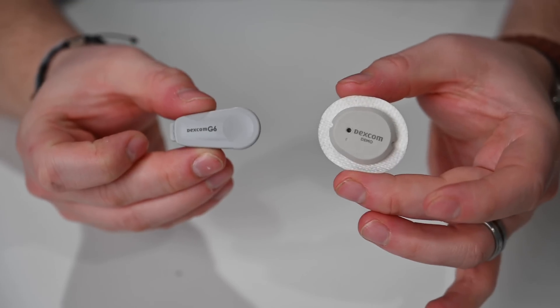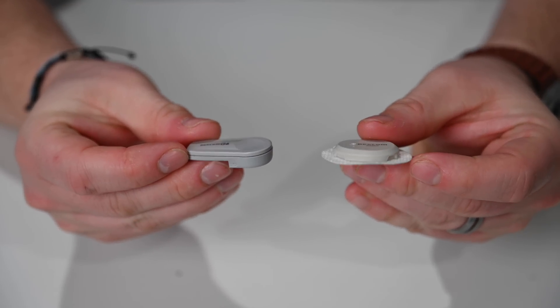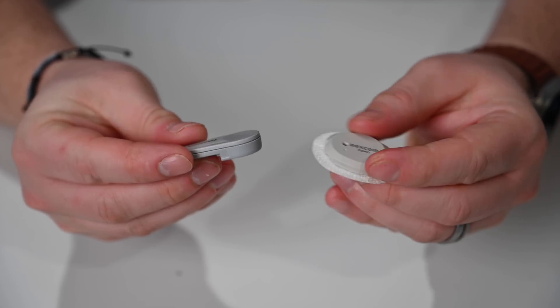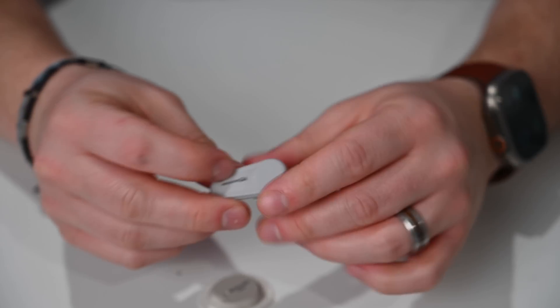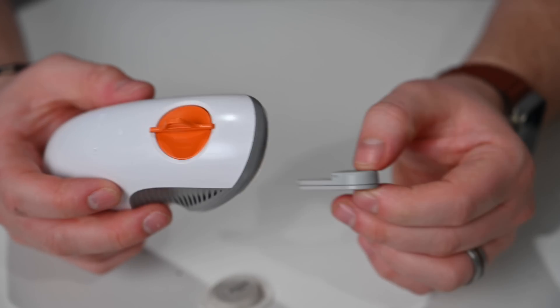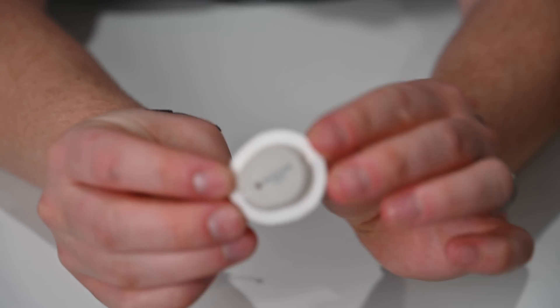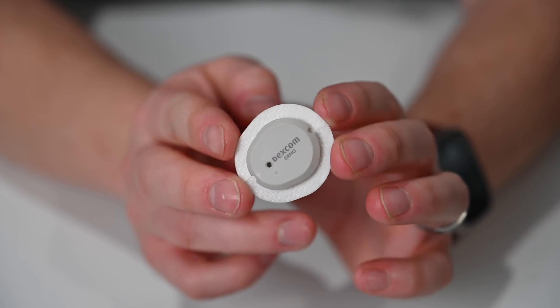Let's take a look at the G7 alongside the G6. Dexcom says the G7 is 60% smaller than the G6. Looking at the pieces side by side, it's a little misleading because the G6 doesn't look much different in terms of overall volume — but that's because the G7 is an all-in-one piece. This is everything you need: the adhesive, the transmitter, the sensor — all in one little piece that gets disposed of after your 10-day wear time.